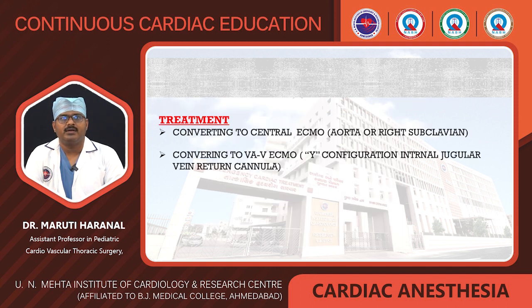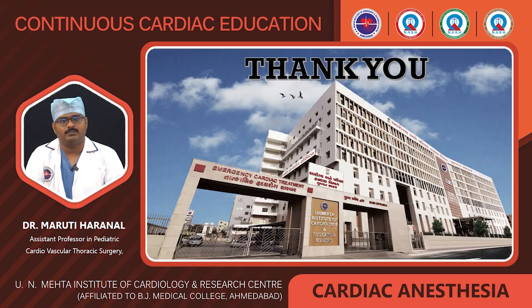This can be treated by converting to a central ECMO, either by cannulating the aorta or the right subclavian artery, or converting to VAV ECMO, where an additional infusion cannula delivering oxygenated blood is introduced into the right internal jugular vein.